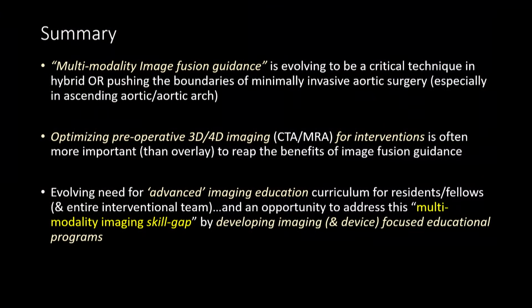I just wanted to summarize. Right on time, as always, Ponraj, 6 o'clock. So this is definitely an evolving field with multimodality image guidance, especially in hybrid operating rooms. By hybrid operating rooms, I don't restrict only to fixed C-arms. It could be any imaging. So even an open operating room can benefit from all these advanced imaging.